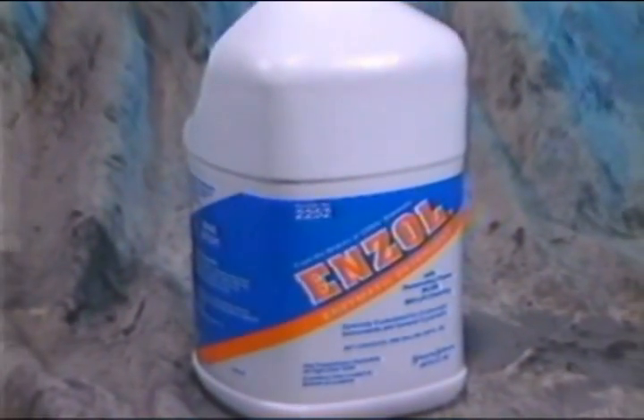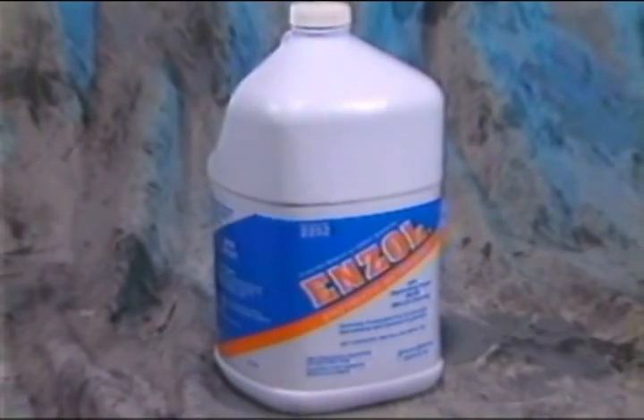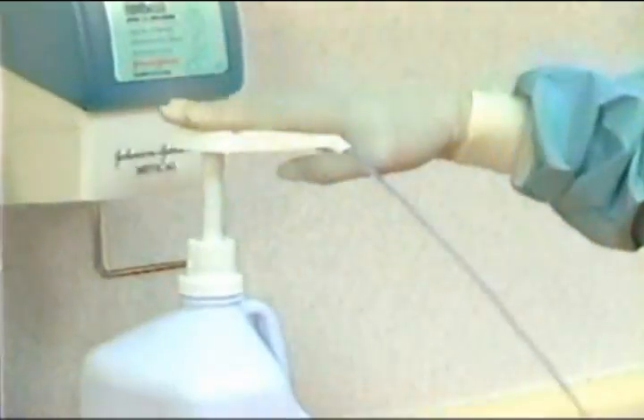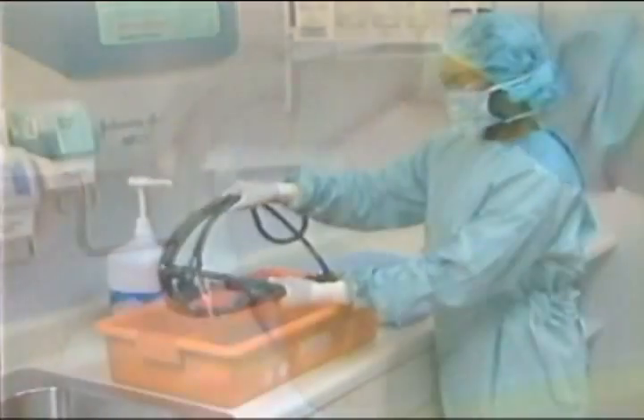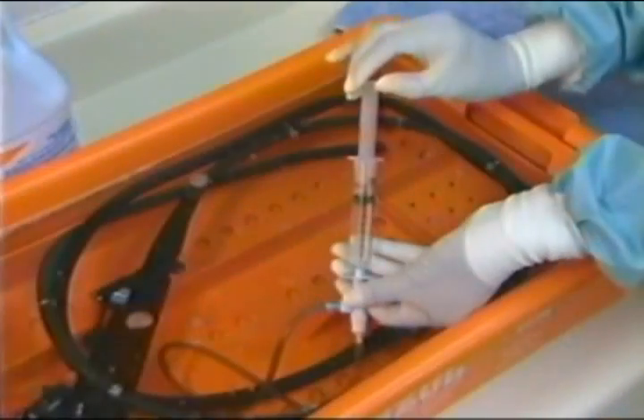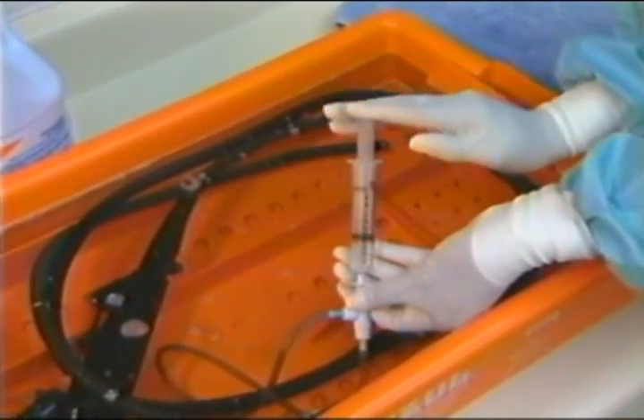Enzymatic detergents such as ENZOL and Cytozyme enzymatic detergent are often recommended for cleaning because they effectively dissolve protein and reduce the challenge to the manual cleaning process. This reduces the likelihood of healthcare worker exposure to contaminated equipment.